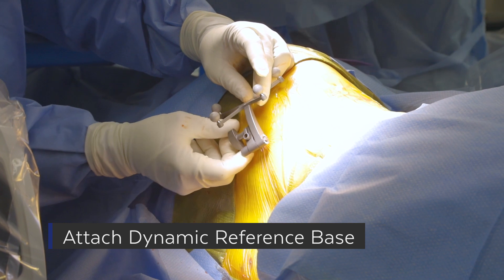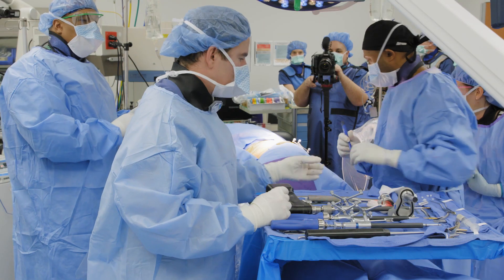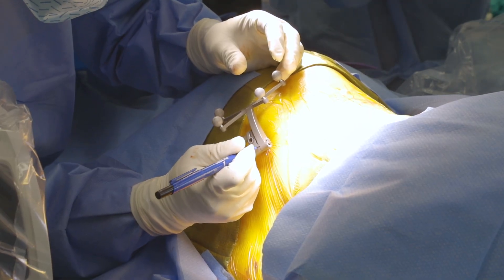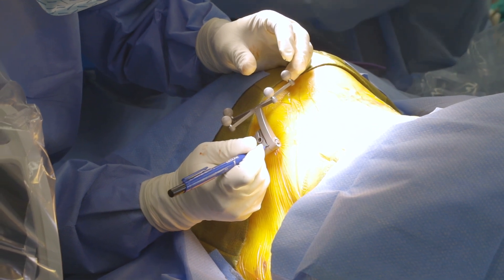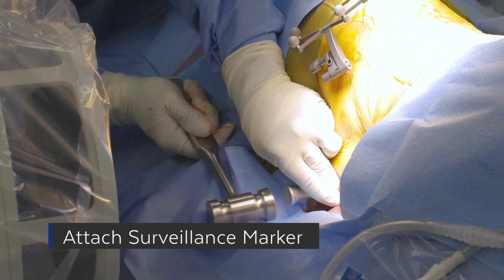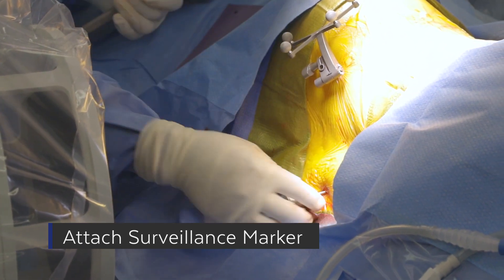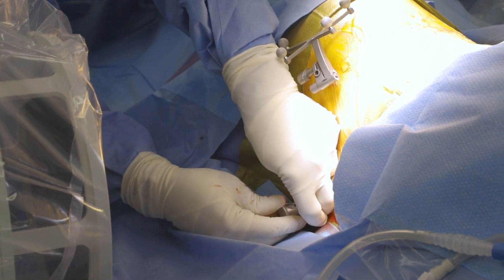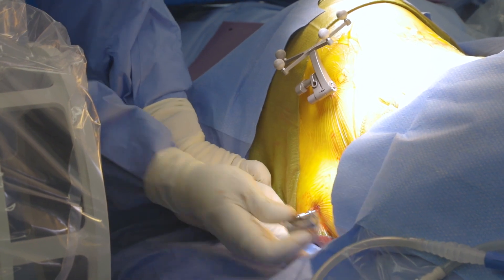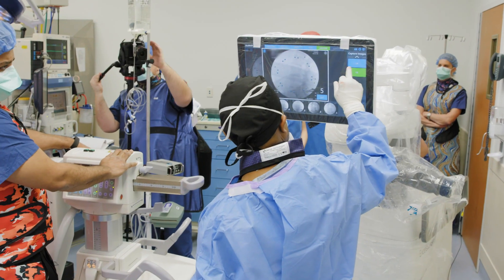Here you see us making sure that the markers are off of the patient. We do make a little mark to ensure that it doesn't move. Here's placement of the surveillance marker in the opposite crest. If the patient's not amenable to placement on the downside, you can also place this on the upside as well — I would recommend doing that through a separate small incision.